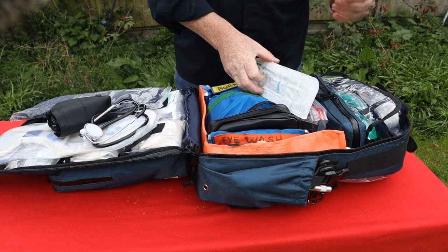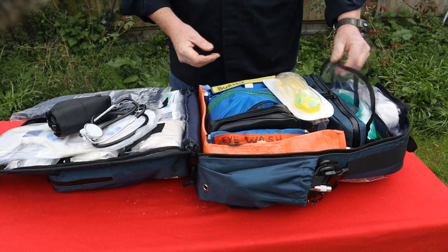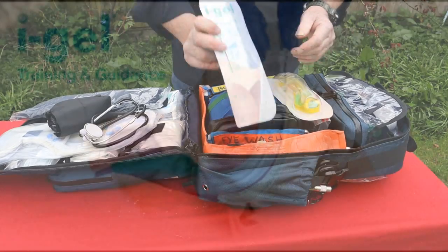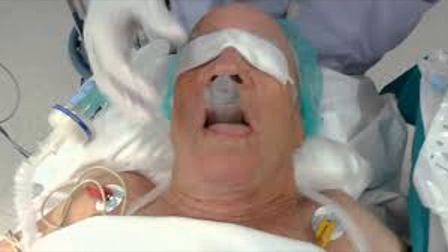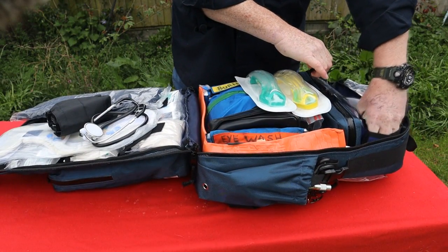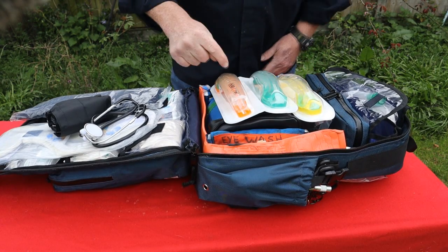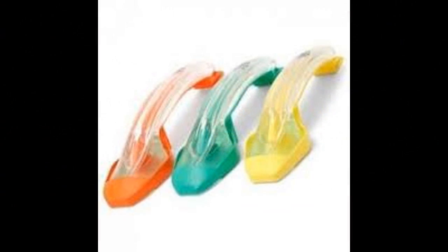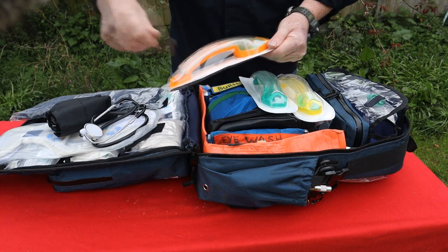Secure airway. ET tubes are advanced life support. They're used by paramedics, anaesthetists, nurse practitioners. These things are called i-gels, and they are absolutely brilliant. If you were to go in for day surgery, so you would have a general anaesthetic, have some sort of minor surgery and come out the same day, you would probably be put to sleep and monitored with this type of airway. So what happens is we have a tube, got some KY jelly, so we lubricate it.